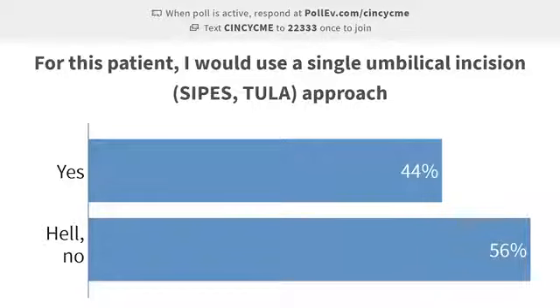Then put the scope in and do the rest of the appendectomy. So I do it two different ways. I'll do an operative laparoscope through the umbilicus, or put the camera and a grasper through the umbilicus, grab it, and pull it up. Either way, it's classic TULA, an extracorporeal single incision appendectomy. So you make Dan happy because you're the cheapest appendectomy in the hospital. We don't know what percent of the total population voted for this, do we?